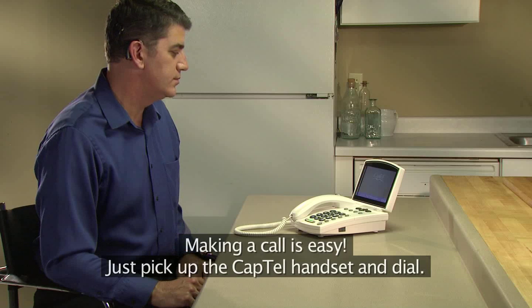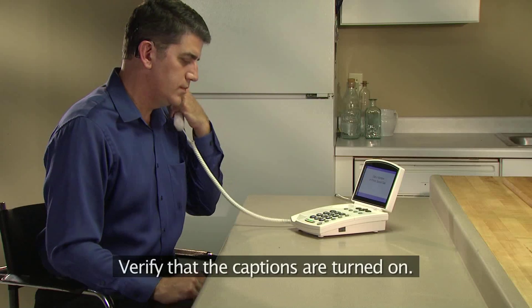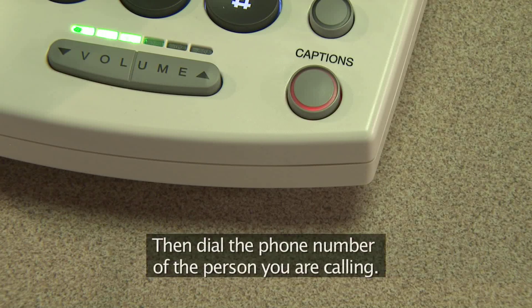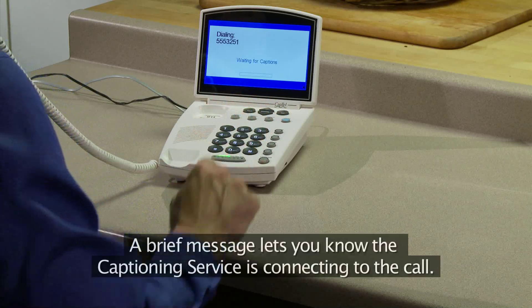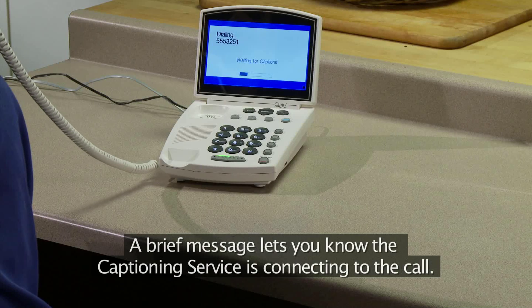Making a call is easy. Just pick up the CapTel handset and dial. Verify that the captions are turned on. When captions are on, the red light around the captions button is lit up. Then dial the phone number of the person you are calling. A brief message lets you know the captioning service is connecting to the call.